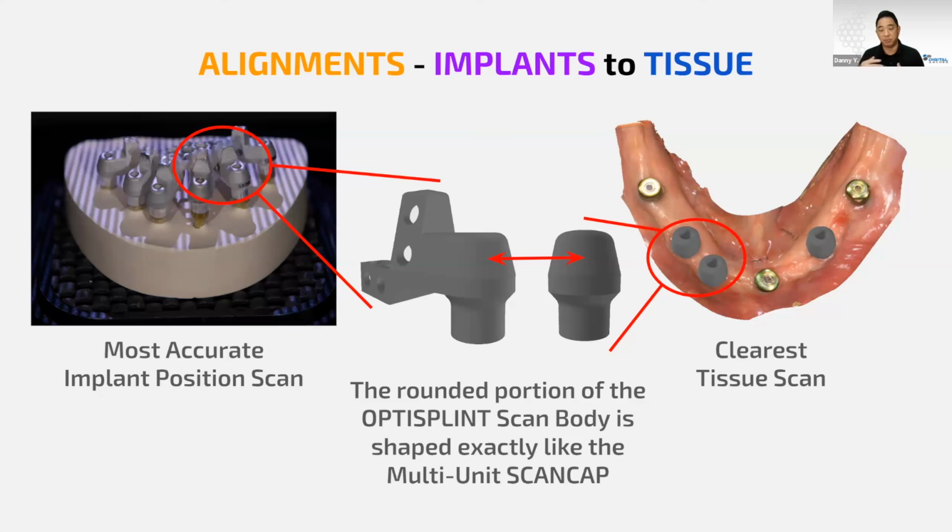Now, that's just an extra step, and we could show you how to do that later on in exocad when we have the exocad webinar, but it's just an extra step that you would have had to do if you only had the scan caps or the healing caps in there. And that typically does also still happen if you're doing a reline impression scan for an edentulous patient with a denture.